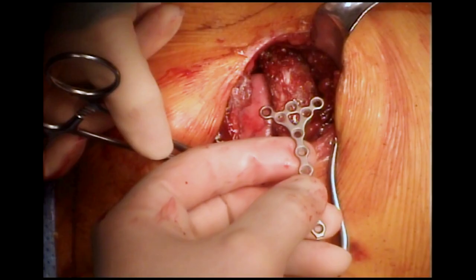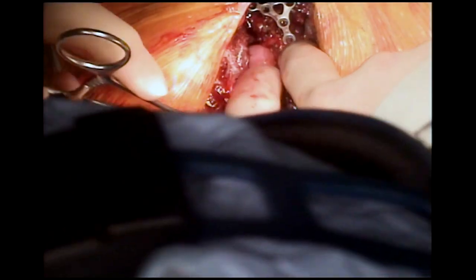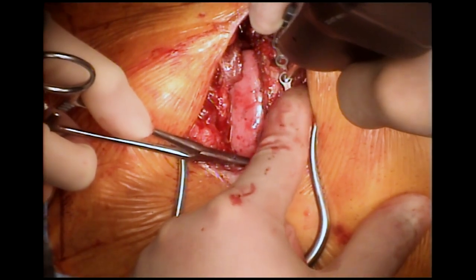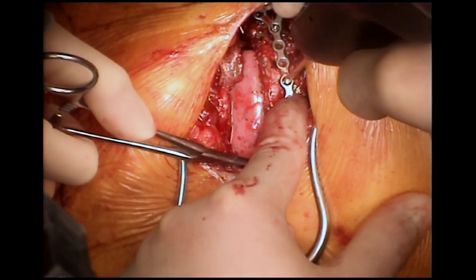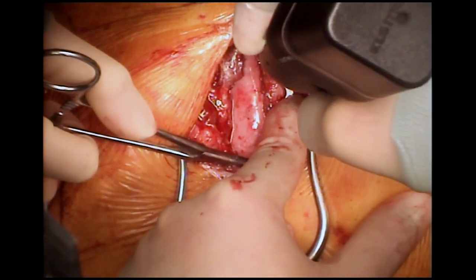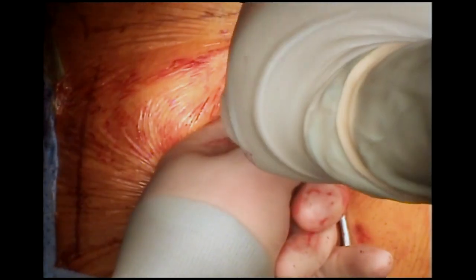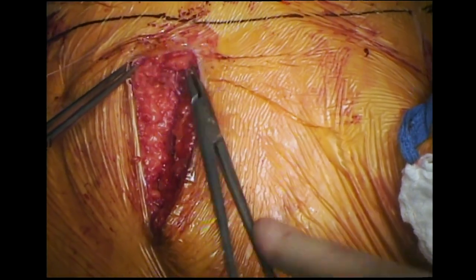The soft tissue retractor is removed and the third rib is fixed with a KLS Martin T-shaped plate shaped to the curvature of the rib, using three screws laterally and three medially on the sternum. Sound fixation helps with chest wall stability and post-operative pain relief. An intercostal nerve block has been performed, and long-acting local anesthetic is instilled in the subcutaneous tissues before performing the standard closure.